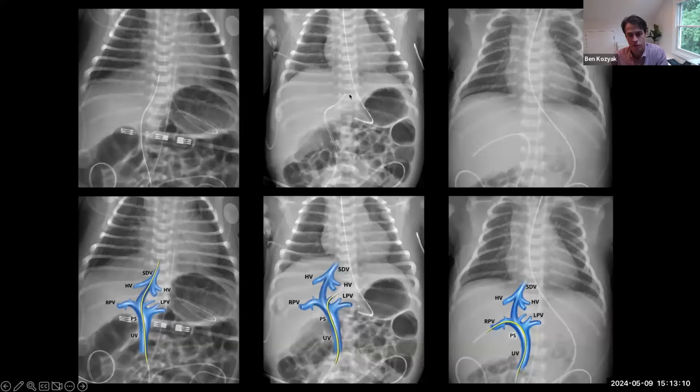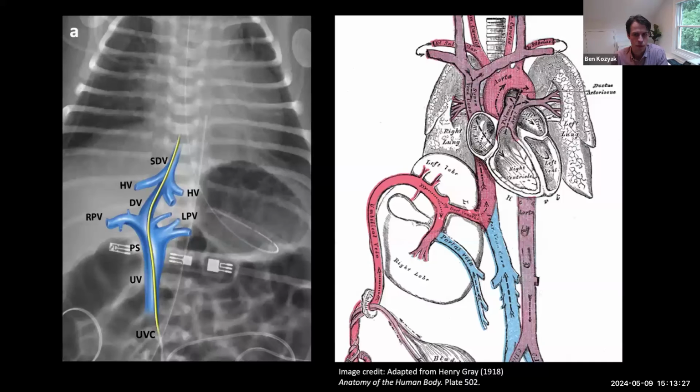there's a reason to use ultrasound to confirm placement of catheters after they've been placed, or if you get a patient where the catheter has been placed by somebody else, or potentially it's moved on radiograph, to confirm that it's actually where you want it to be. And there's literature for that as well.